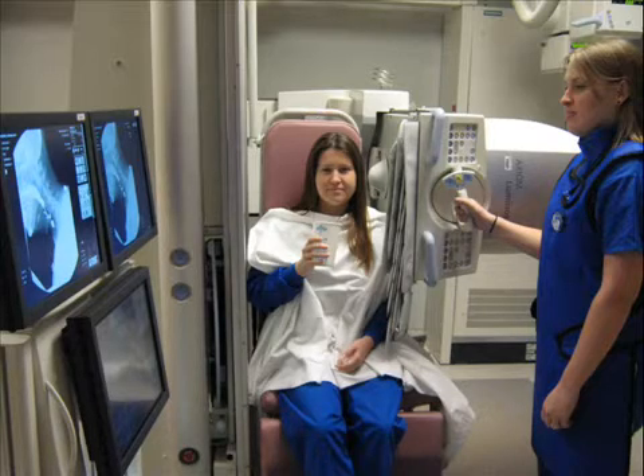A lead apron will protect your reproductive organs from radiation exposure. You will be asked to stand or sit in a special chair during this examination.